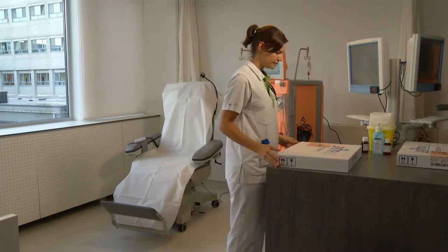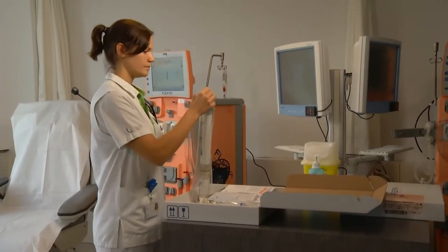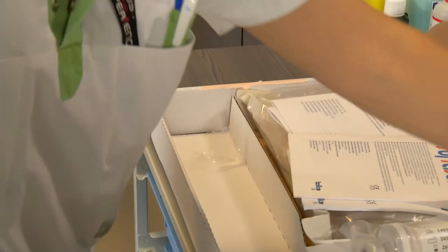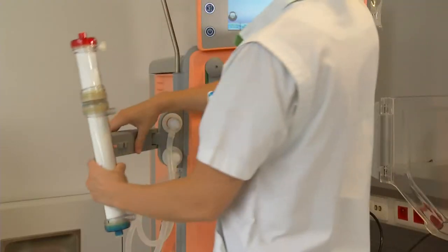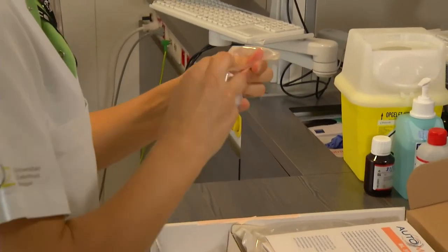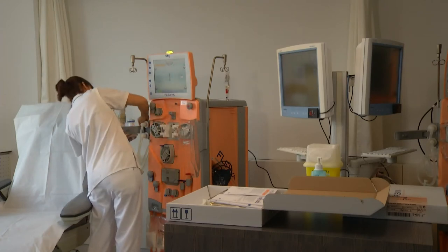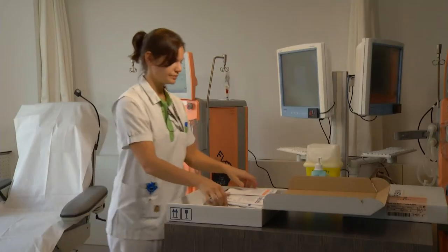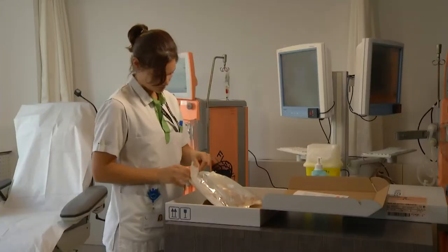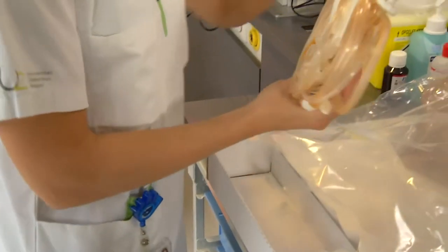The disposable seen here in a cardboard box consists of three parts. Capillary dialyzers for hemodiafiltration with reinfusion, HFR. A sorbent cartridge for the regeneration of the ultrafiltrate, SupraSorb. And tubing for hemodiafiltration with endogenous reinfusion. It is important to avoid the risk of infection. Therefore, we work aseptically during assembly as well as during treatment.